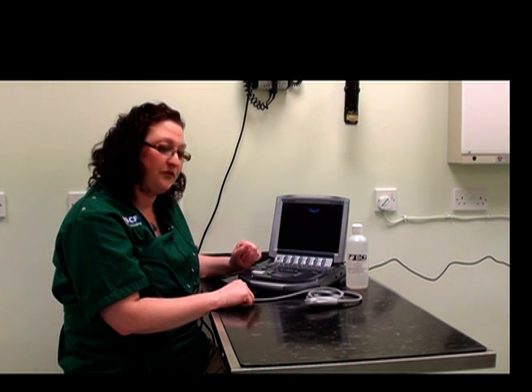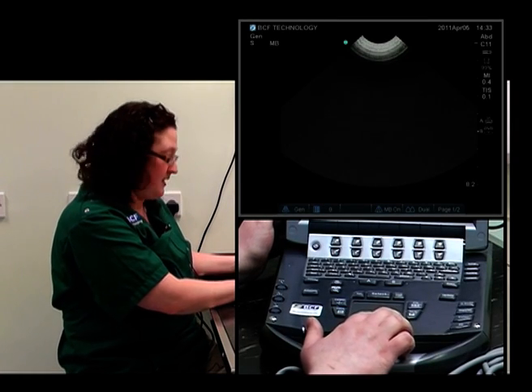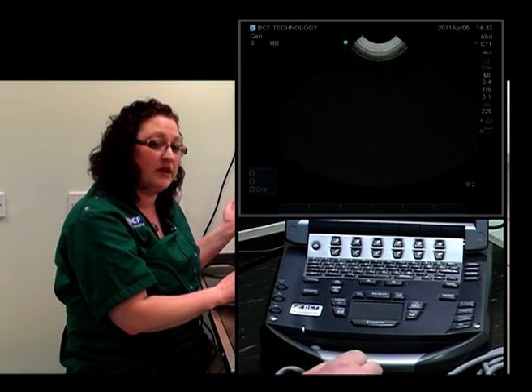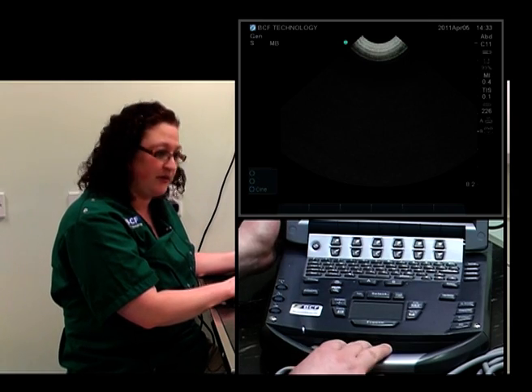Another button which is important to note the location of before we get started is the freeze button. That will help us so that if we see a really good image, we can stop it and scroll back a few frames to get the best image of what we're trying to look at. On this machine, it's located right underneath the touchpad. After freezing the image, we can save it, make annotations, take measurements — all sorts of things. So it's very useful to know where that is.